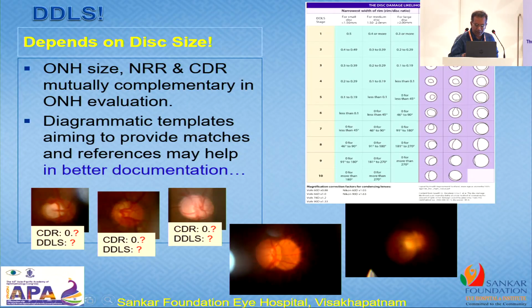So here we are taking the 1 millimeter spot size that is photographed alongside the disc, and whether it is equal to 1 millimeter or 1.6 millimeter.